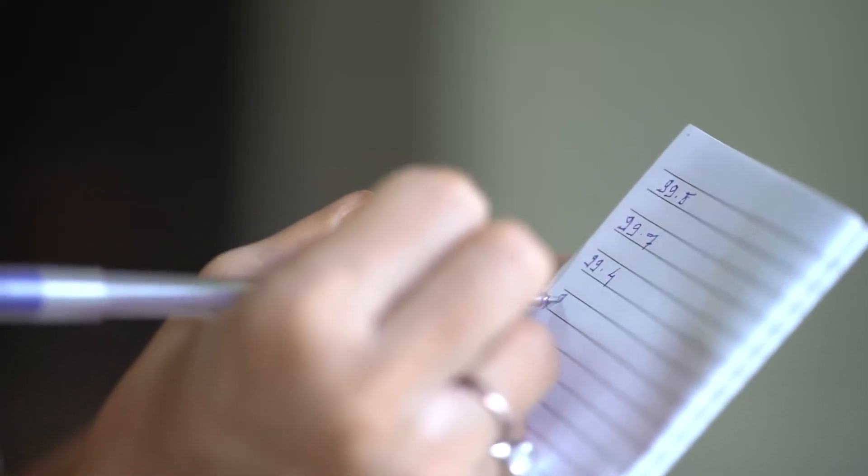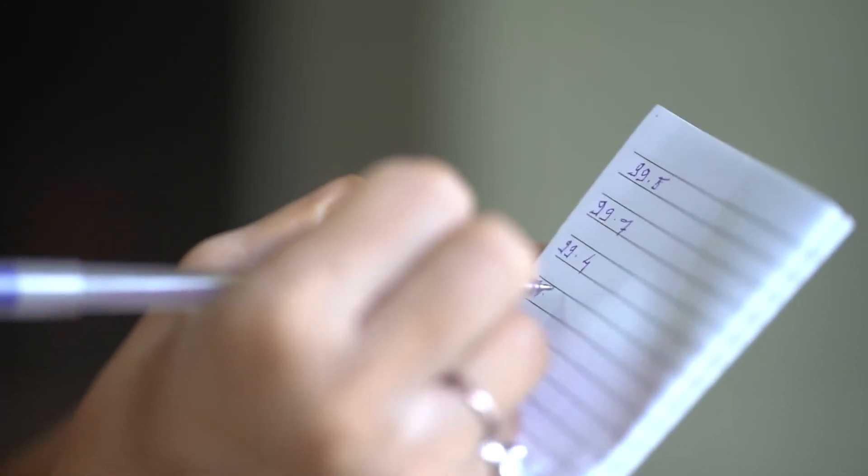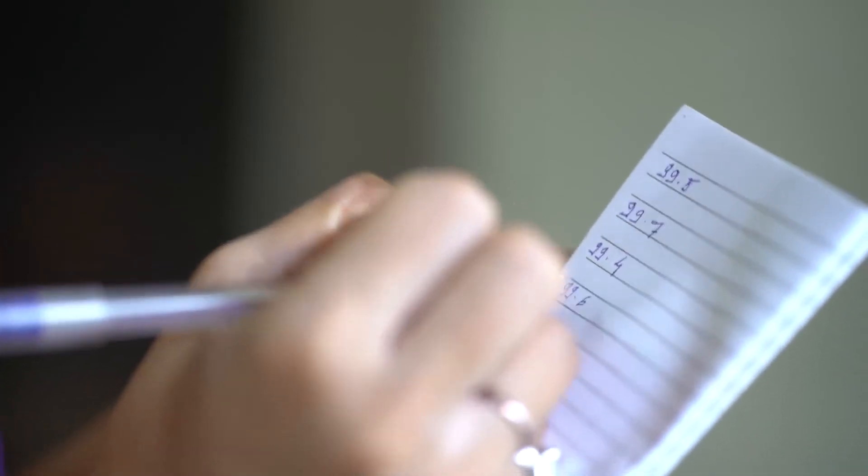Make a note of the child's temperature and time. Keep a daily record of the child's temperature by measuring it at the same time every day.